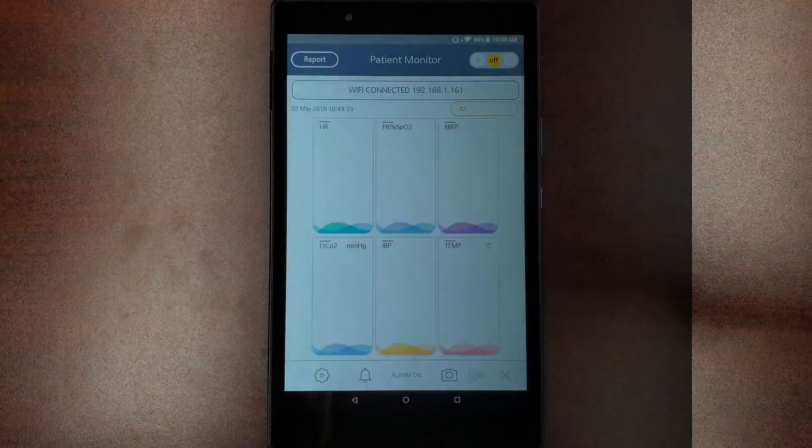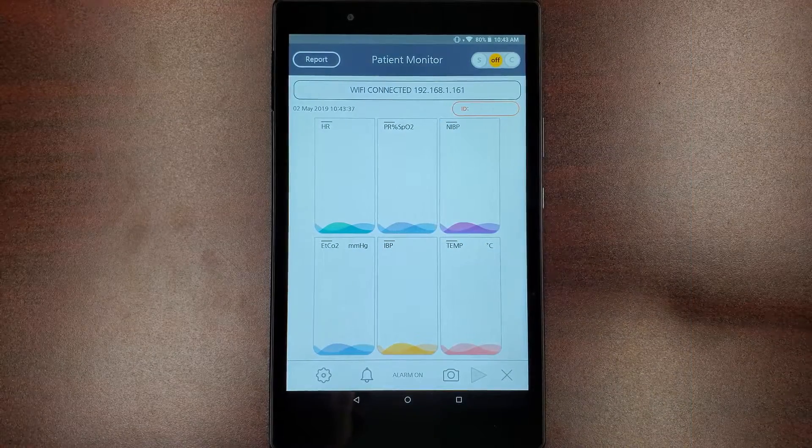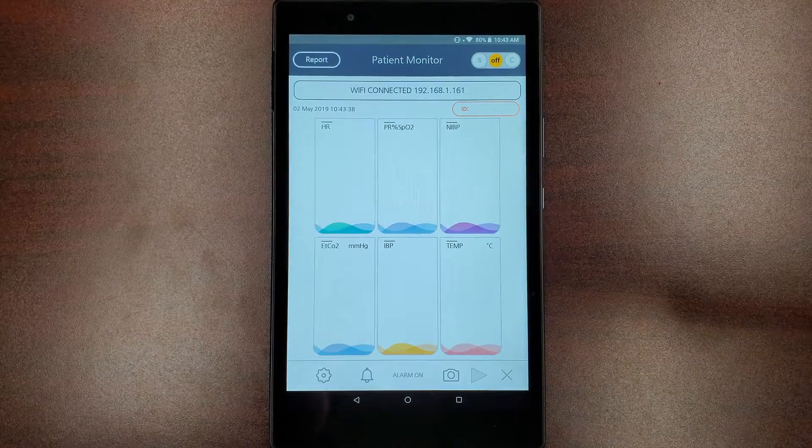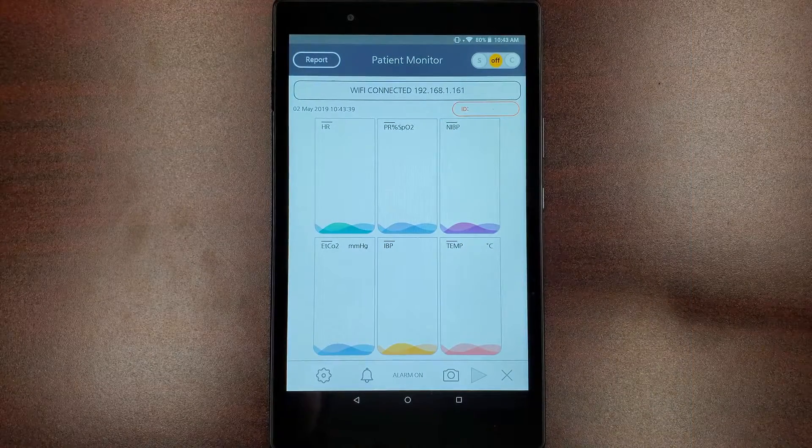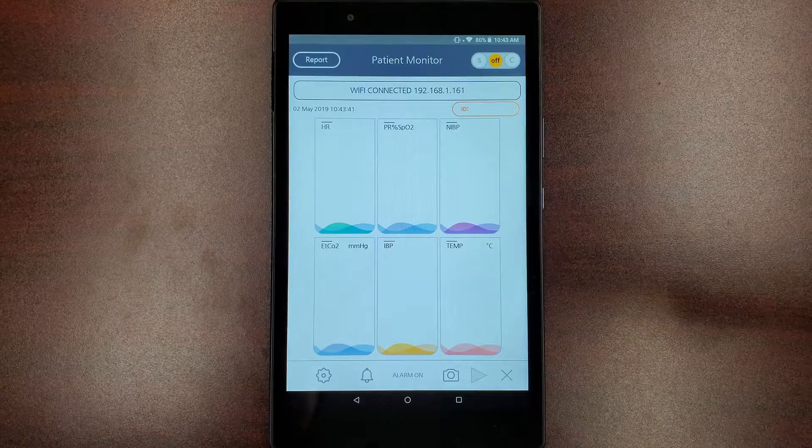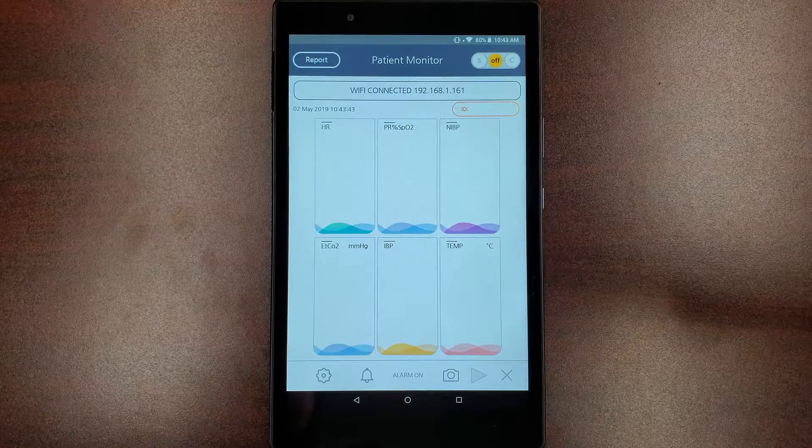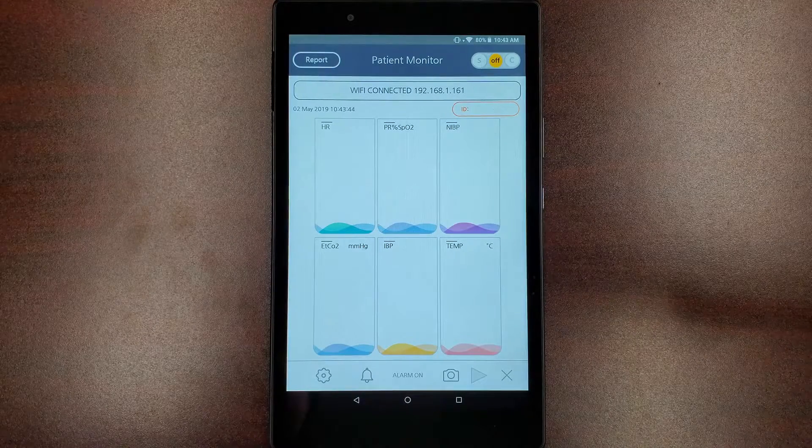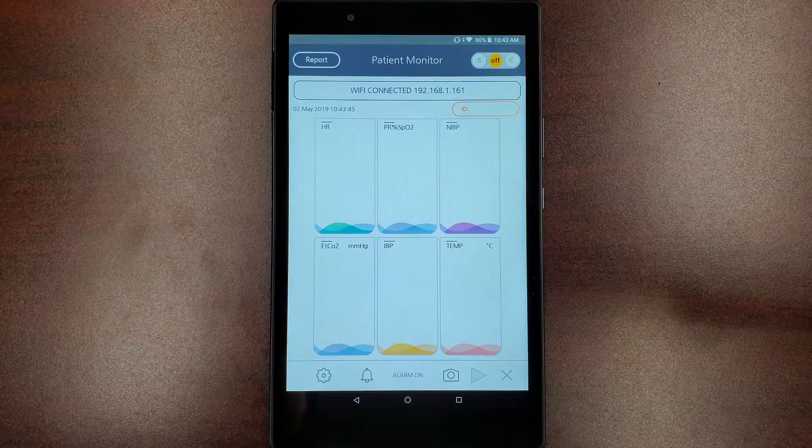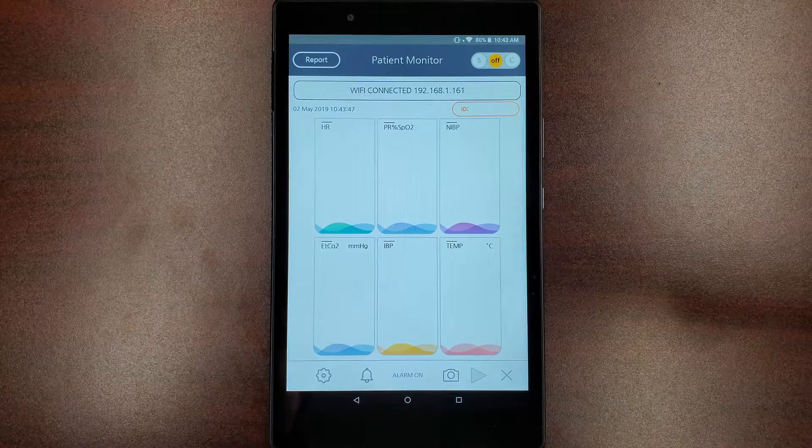Client mode is best used when you would like several mobile devices to access data from a patient monitor. This mode connects multiple mobile devices through the use of the BT Link computer software on a desktop computer.